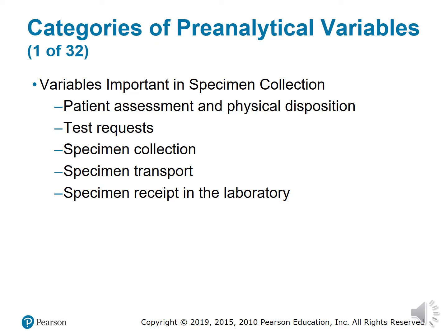Proper collection of blood samples is another way that a phlebotomist can avoid errors. Do not underfill or overfill collection tubes, properly invert tubes, and follow any special instructions on how to transport specimens. If a test states that the tube must be protected from light, guess what you have to do? Protect that tube from light.